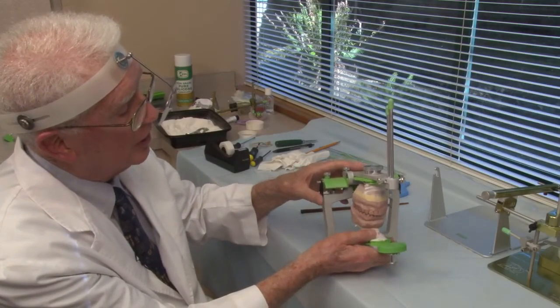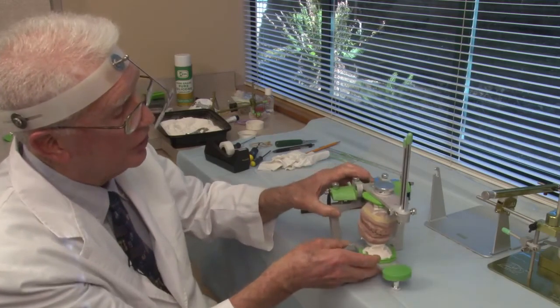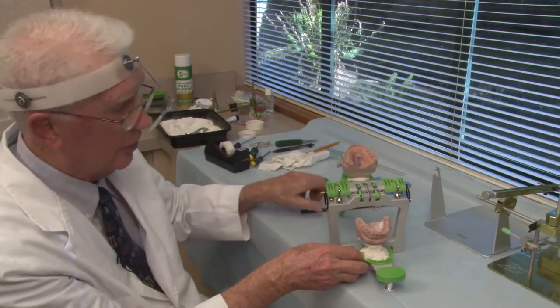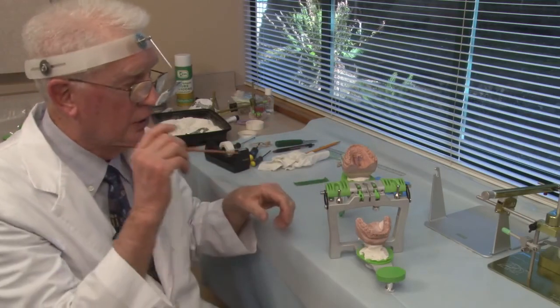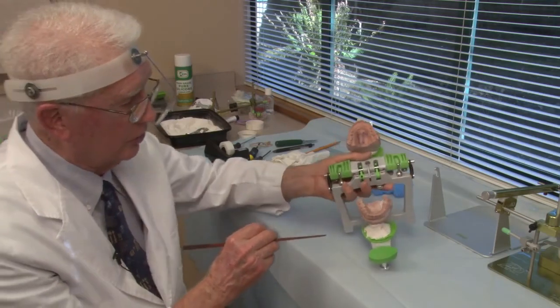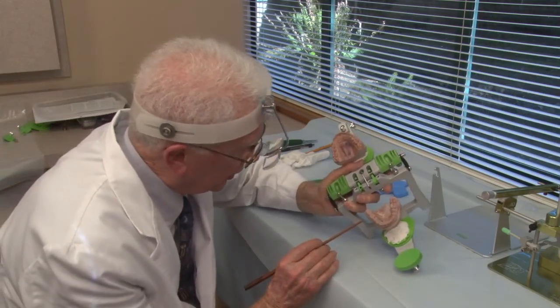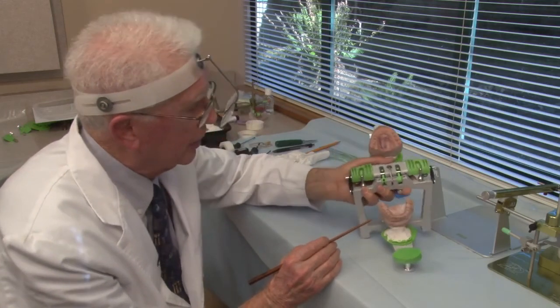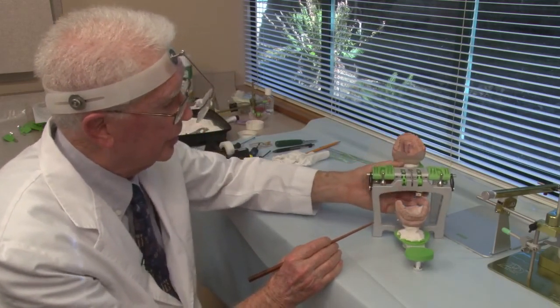Now we can see what she's done to her teeth. Now remember, she's a young lady, a young, healthy person, but let's look at what she's done to her teeth already. She's lucky that Dr. Mills is her dentist, because look at the wear patterns. Look at this tooth here. Let me get another set of models so you can see this more clearly.